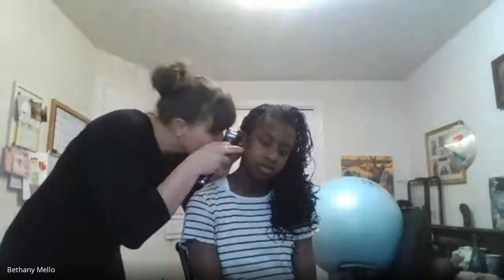Another method is you can hold it like this, and then what I'll do is I'll just have one finger out, and I'll brace that finger. So again, same concept, move your head. I'm going to move with her, okay? So as I'm really bummed that this light is out. I must have been sitting there with the light on. Pulling up and back, I'm going to be looking at the external ear canal as I'm going in, and then I'm going to be looking at her tympanic membrane.